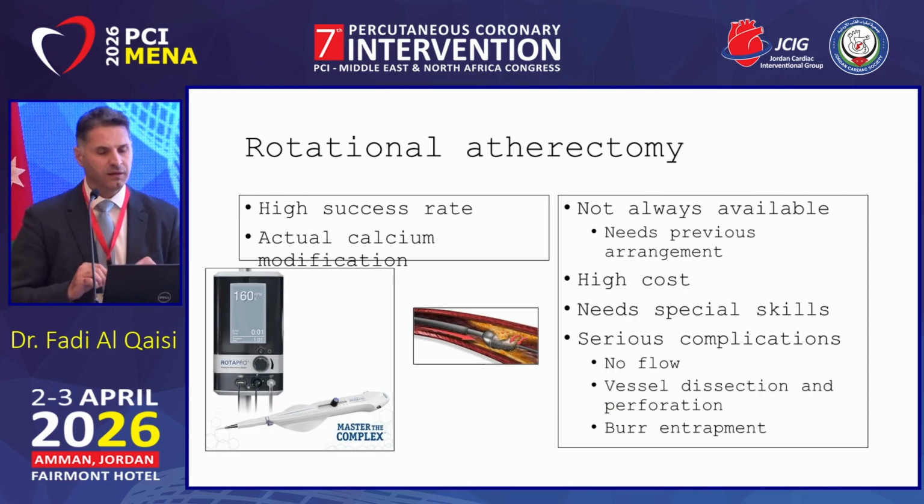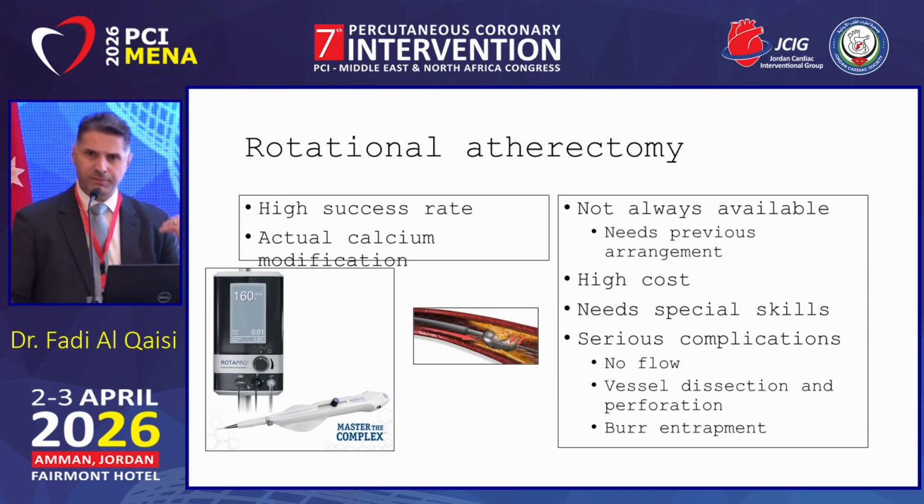الاداه الثالثه اللي هي روتيشنال اثيركتومي عندنا فيري هاي سكسس ريت فيها اتس اكشوال كالسيوم موديفيكيشنز مشكلتها not always available بدك بريفيس ارينجمنت ابو رعد جيب لي الجهاز بكره عندنا كالسيوم جيب لي البيرز سايزز جيب الجهاز وهاي كلياته هاي كوست ومعظم التامينات ما بيغطوها والحمد لله تعالى.